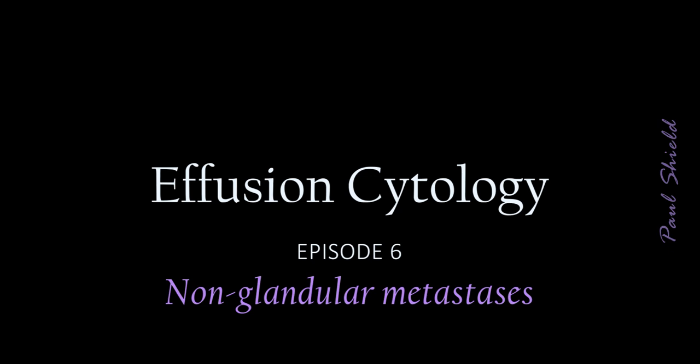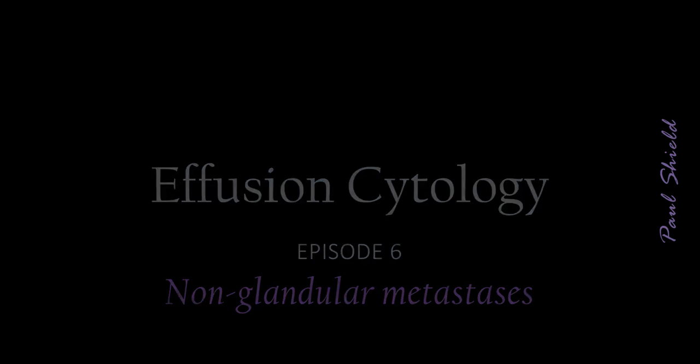In this clip I want to look at malignancies in effusion specimens that are not glandular, so not adenocarcinoma. Adenocarcinomas make up about 80% of malignancies in effusions, but there are a whole range of other things. We're just going to look at 3 of those, and the first of these is metastatic melanoma. This is a really difficult diagnosis sometimes.